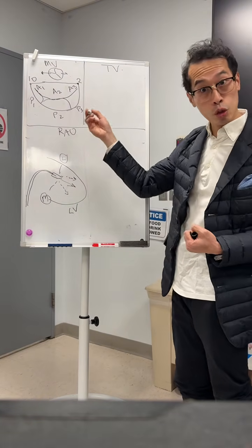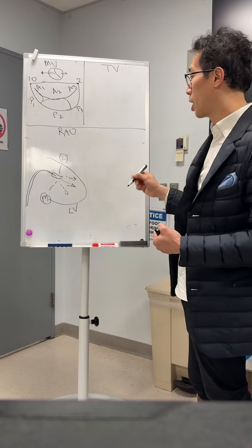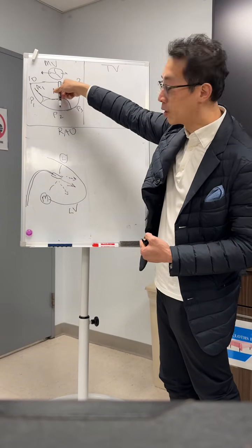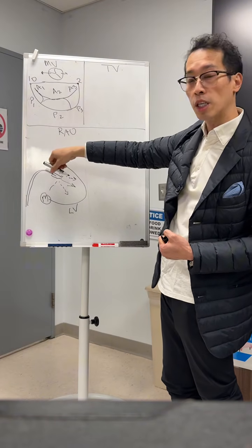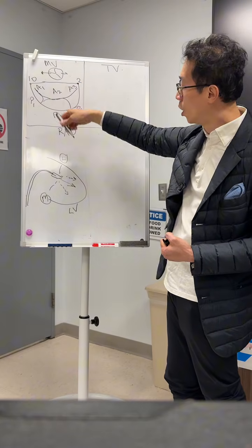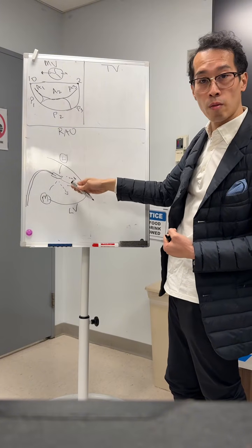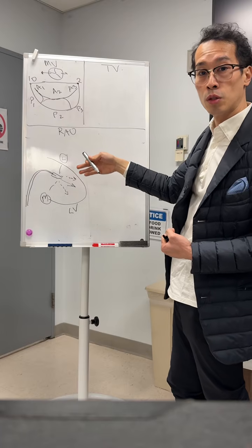And of course, on echo, I'll show you in a moment in the next drawing how that translates. But this is a very important point. And once you optimize your orientation of 3D en face, you want to take the parallax out, because that means this projection is exactly perpendicular to this. So when you go into the ventricle, if you rotate and spin, you'll note it right away on fluoro, in addition to echo going in on the 2D.